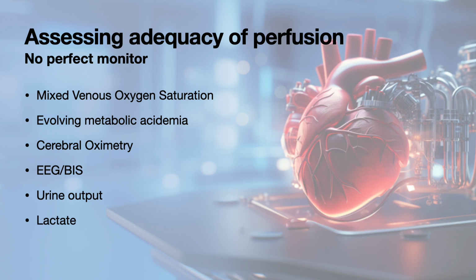Following lactate while on cardiopulmonary bypass may be a trendy, if not fully validated, indicator of poorly defined badness. Even during non-cardiac surgery, the routine use of lactate levels intraoperatively is controversial. Let's sum it up by saying that there is no definitive marker for adequacy of perfusion while on cardiopulmonary bypass. Rather, a combination of reassuring indicators combined with the judgment of an experienced group of people in the operating room are the patient's best protection.